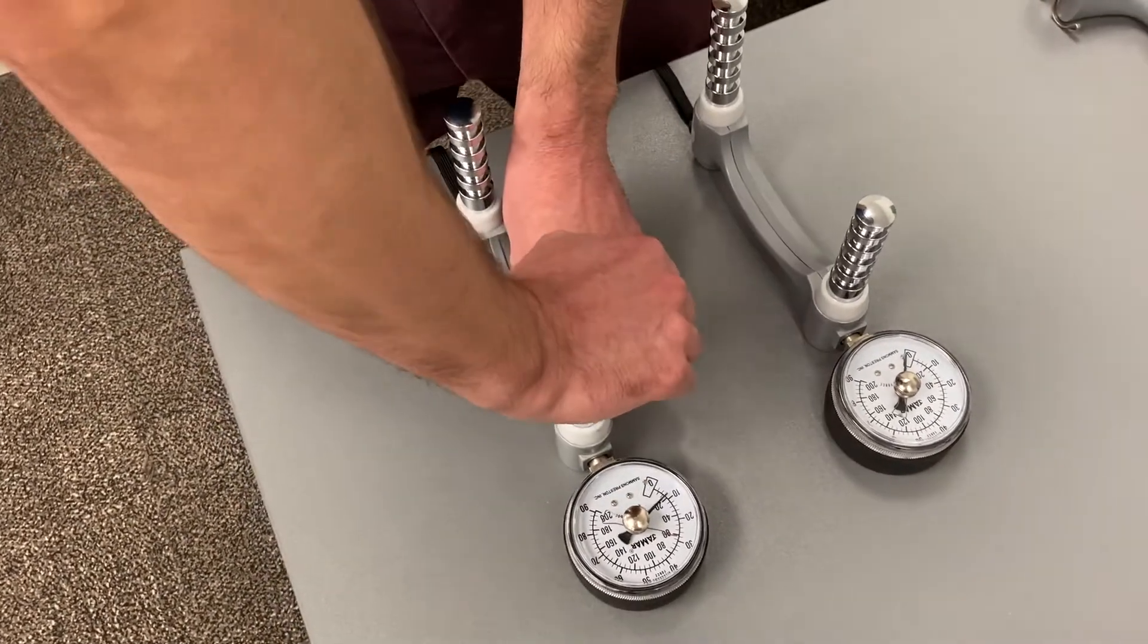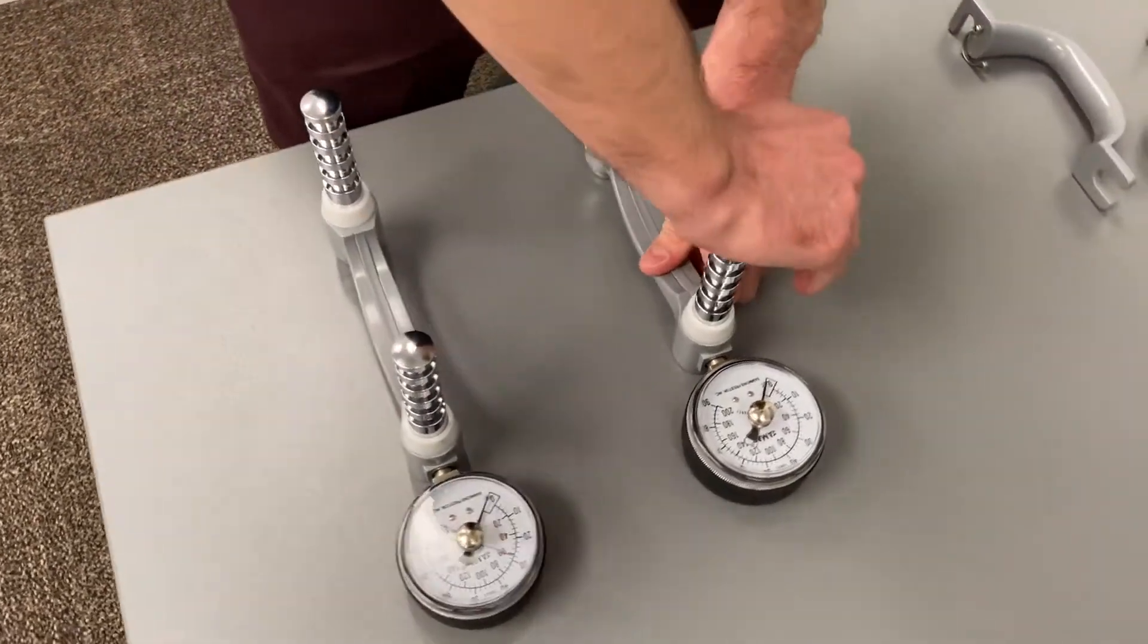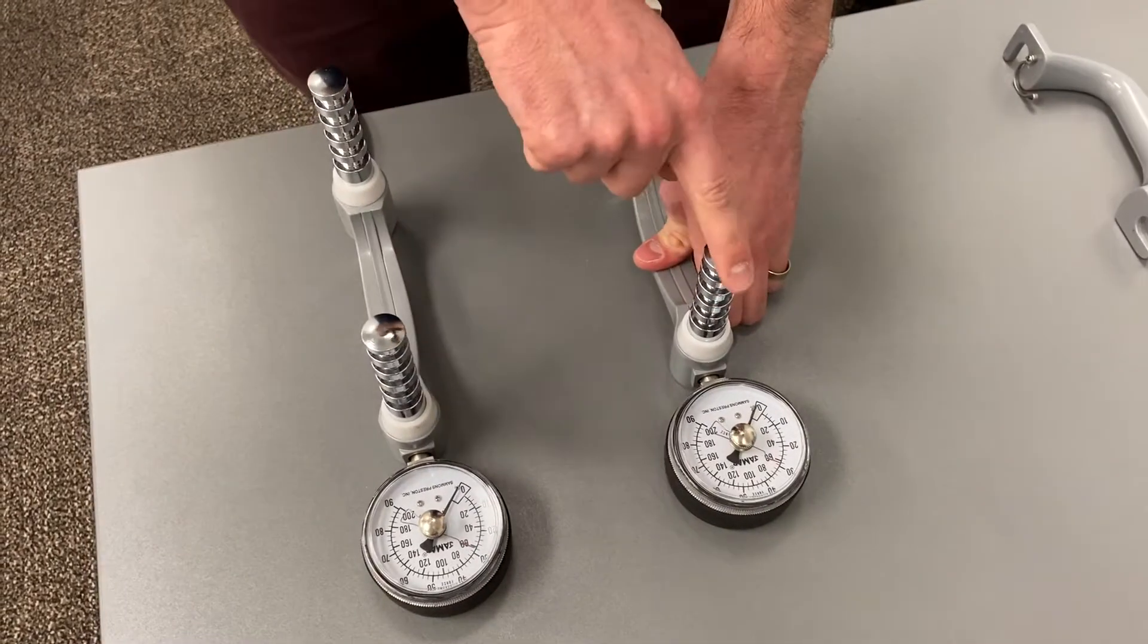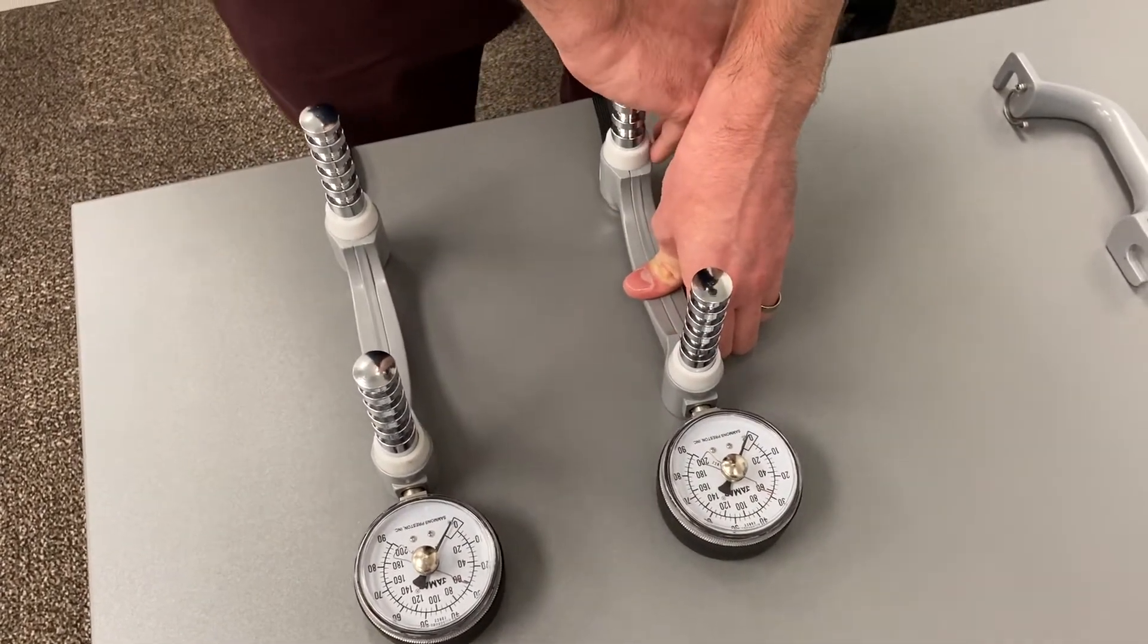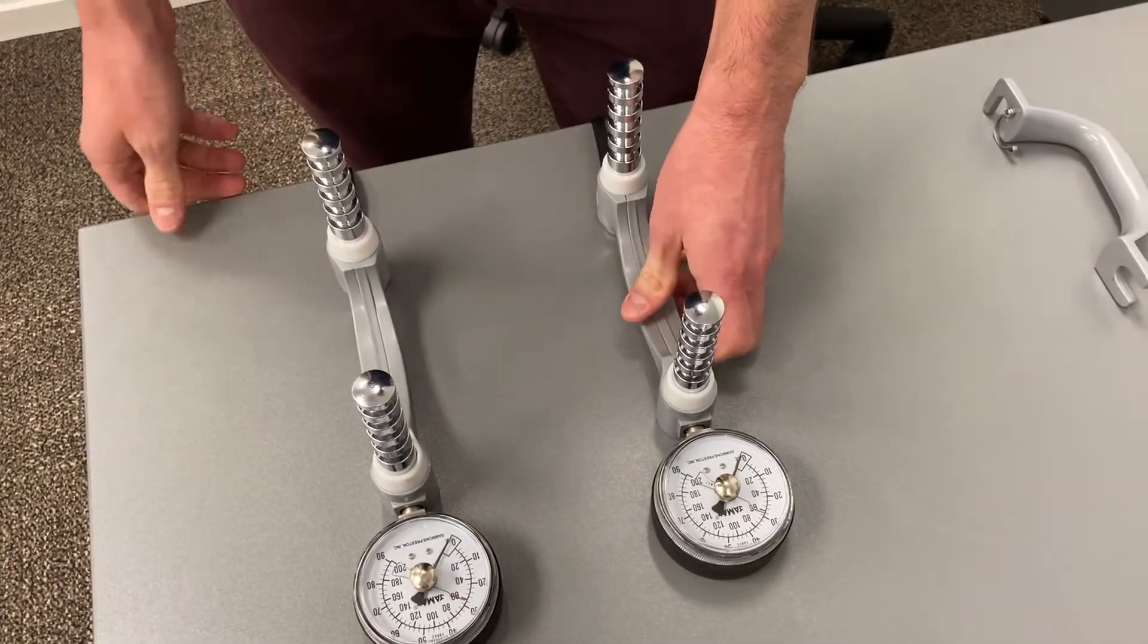They're working just fine as you can see on the dial there. And then if we test this one, this is an example of one that is working fine at the top but not at all at the bottom. Therefore this dynamometer is broken so we wouldn't go on to calibrate that one.